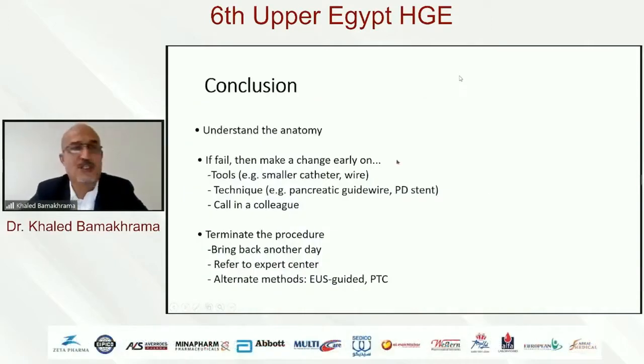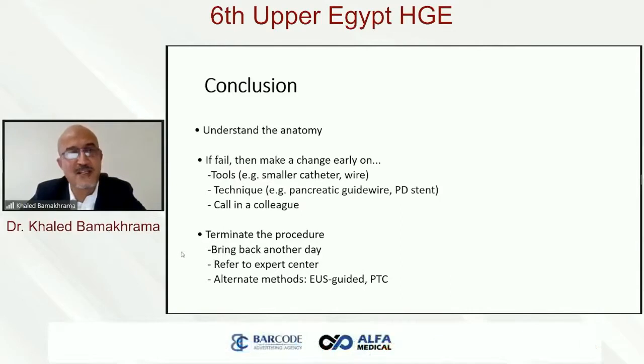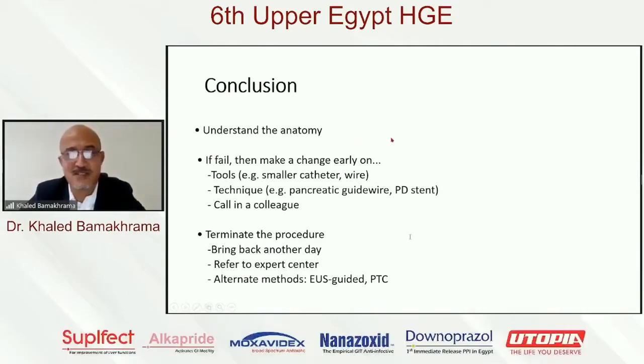So to conclude, ladies and gentlemen, understand anatomy. You need to be cool, especially when you have difficult cases. If you fail, then make the change early. You have to know your instrumentation: small catheter, short wires, hydrophilic wires, angled technique. Try to change as early as possible.